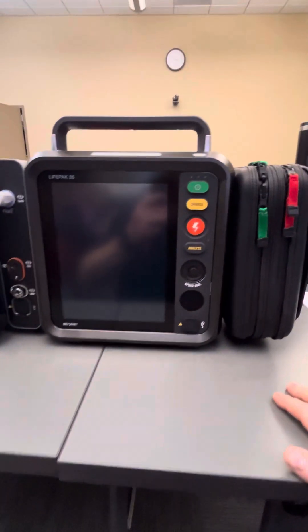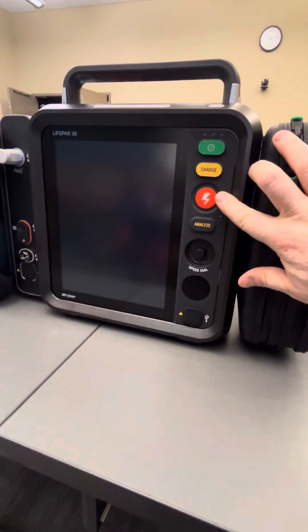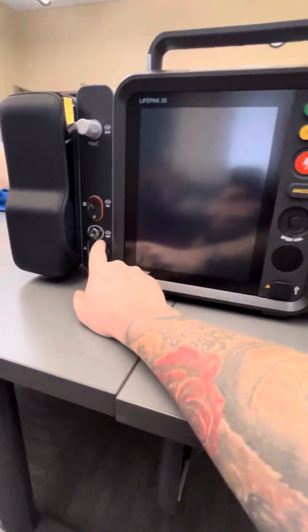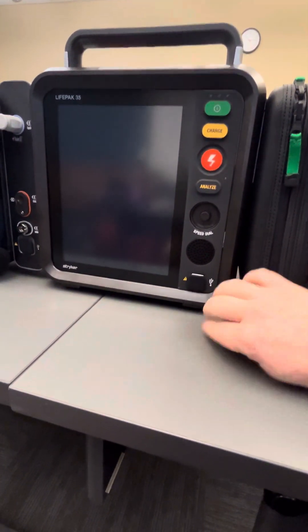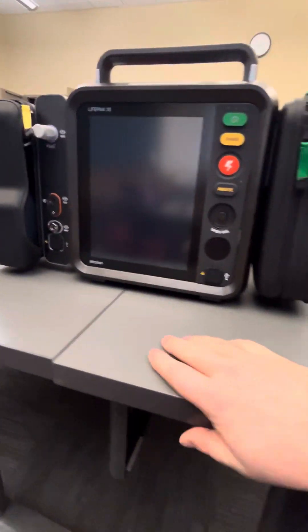Looking at the different buttons, you have your power button, your charge button, your shock, analyze, your speed dial, your speaker, and then you'll notice two plugs with USB ports. These are not to charge your cell phone. They are for additional features possibly down the road, but for now nothing should be plugged into those.